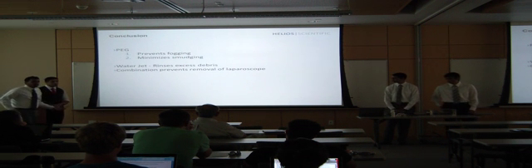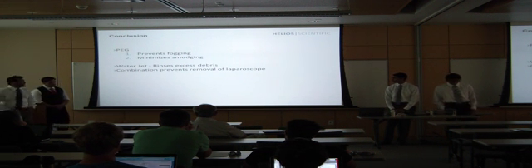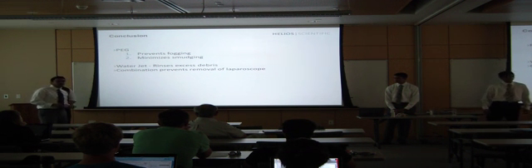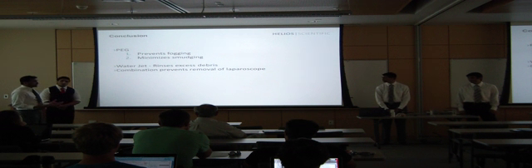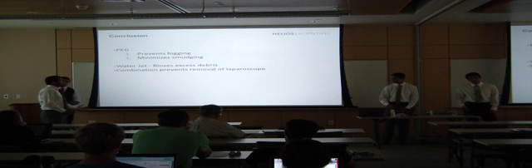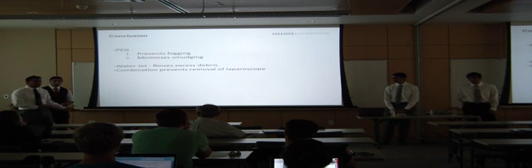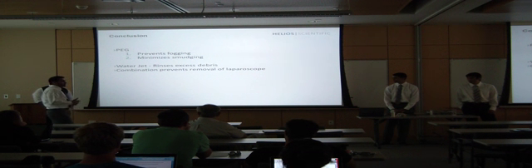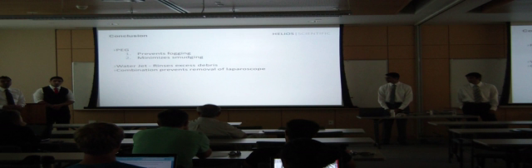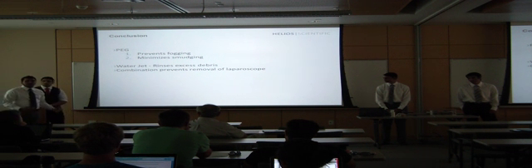So in conclusion, we found out a few things. We know that PEG prevents fogging, which is one of the main goals, and two, smudging, which is actually more important than fogging. Now, with the jet that we created for the laparoscope, we can rinse off any excess debris that might have gotten stuck to the lens even with the PEG on. And so with the combination, we can prevent removal of the laparoscope during the procedure.